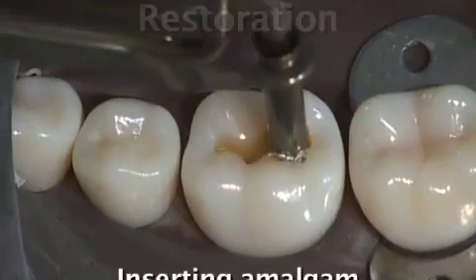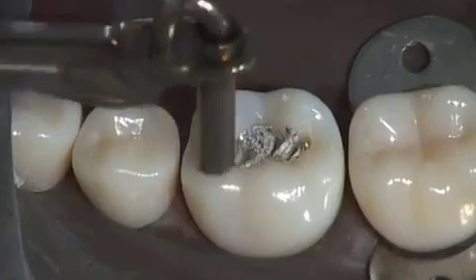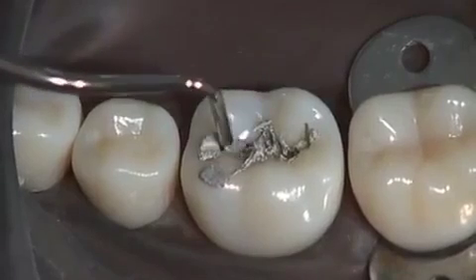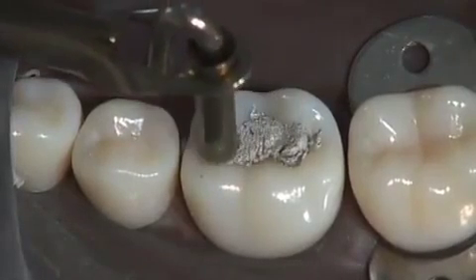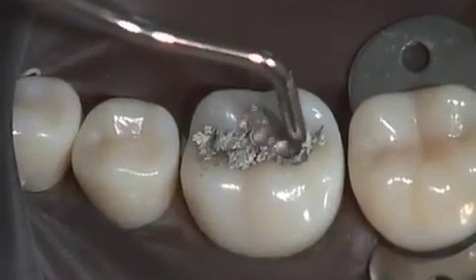After loading a triturated mix of amalgam into the amalgam carrier, insert it into the base of your preparation. With the small end of the condenser first, compact the pliable mass of amalgam against the internal line angles of your preparation. Place new amalgam as needed, and condense firmly and thoroughly to ensure that no voids are present.